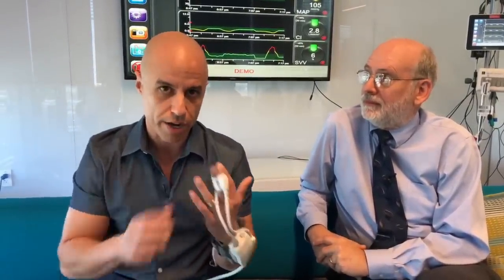All joking aside, this real-time data is fascinating. For me, it's fascinating because ever since they plugged me in right as I started the show, my initial blood pressure was like 120. The minute I started looking at it, it creeps up. That is like a type of white coat hypertension, and I've always had this. It's an adrenergic response where I get sympathetic overdrive.